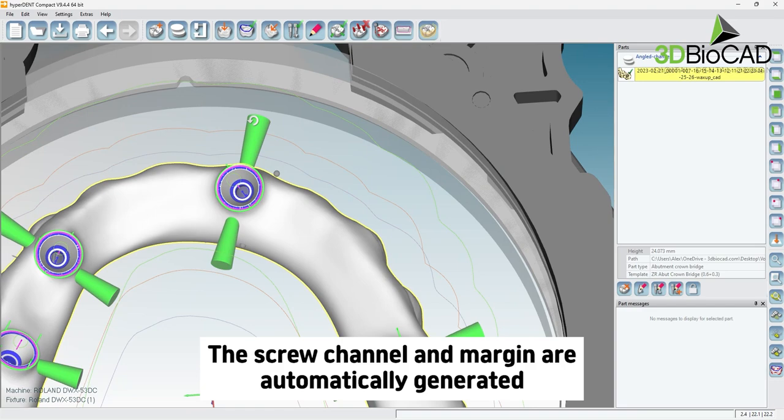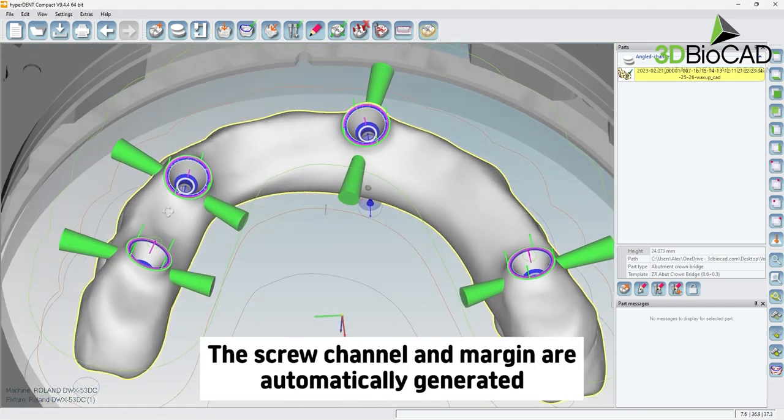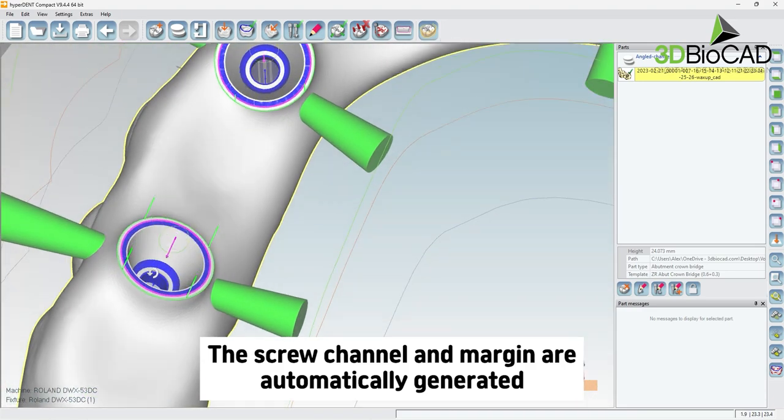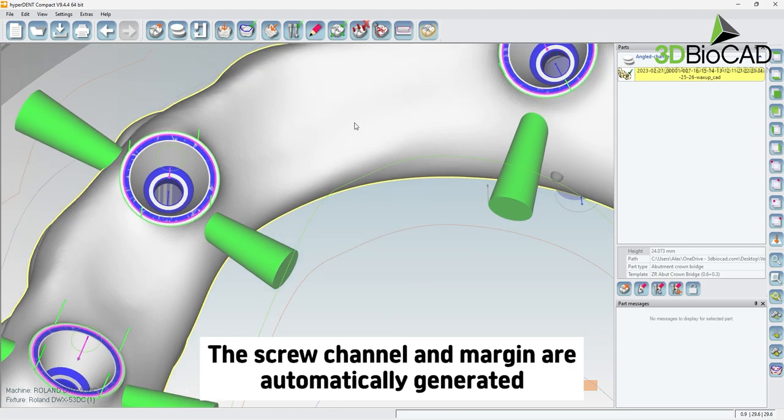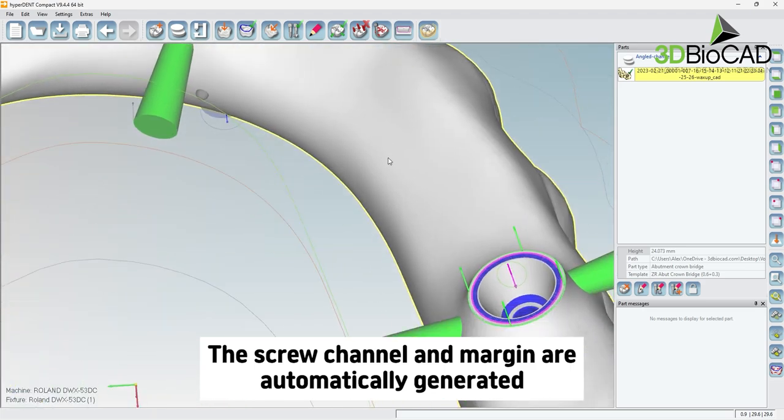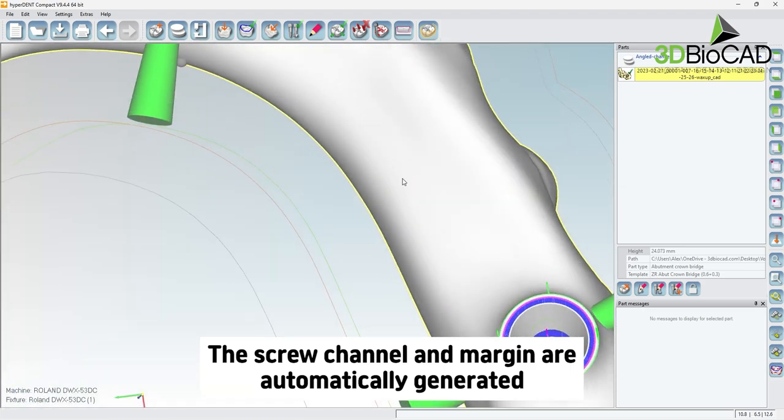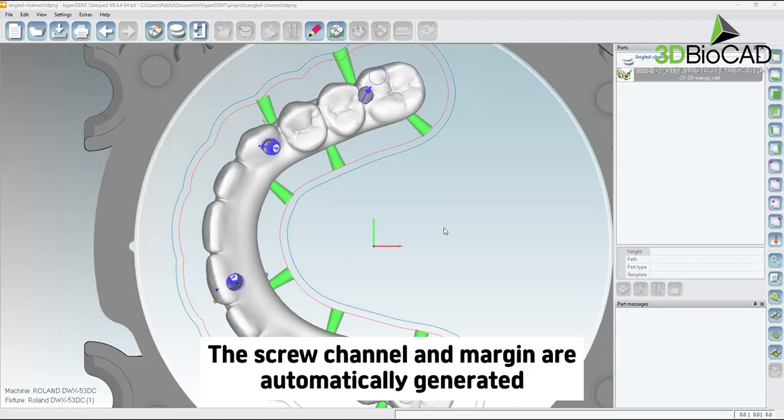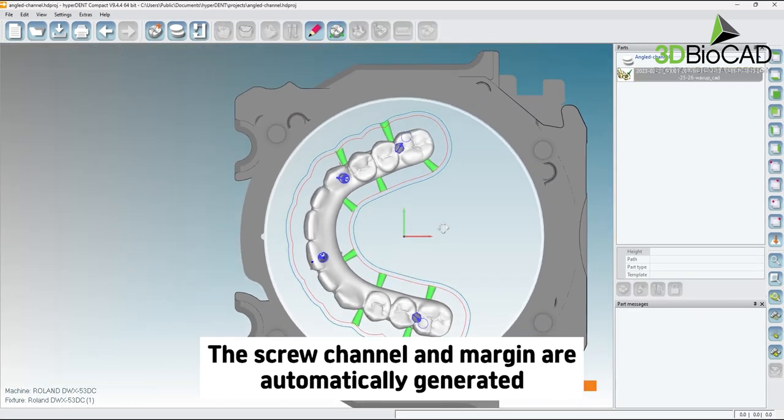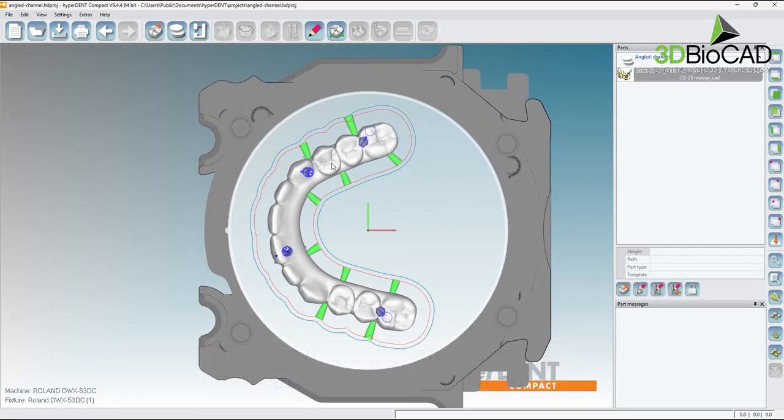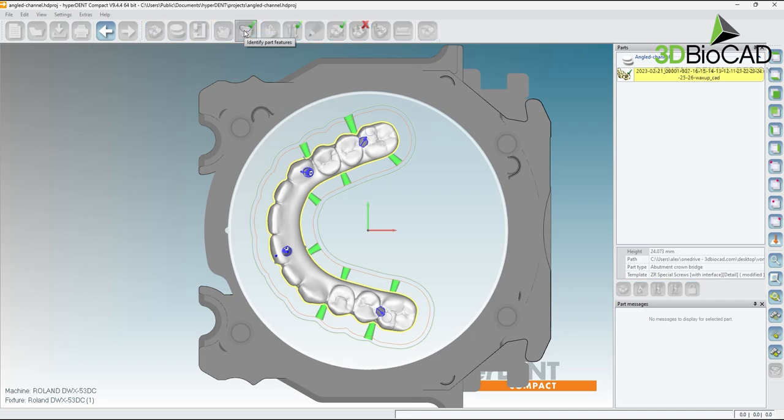A construction info file should accompany the STL file in the same folder, preventing the need to manually mark margins or emergence profile. Please verify the abutment margin line is pink in color and the emergence profile is green. Keeping the additional files such as a construction file are important to protect the interface.